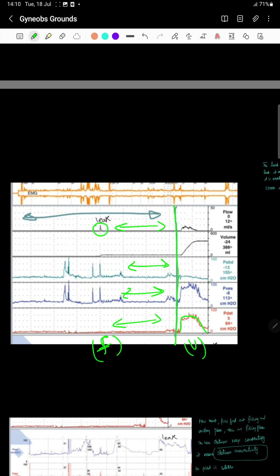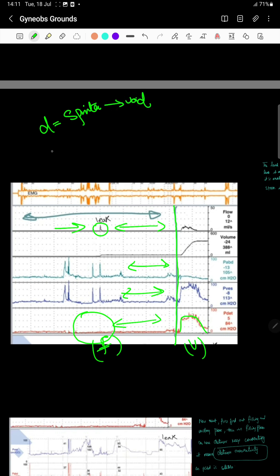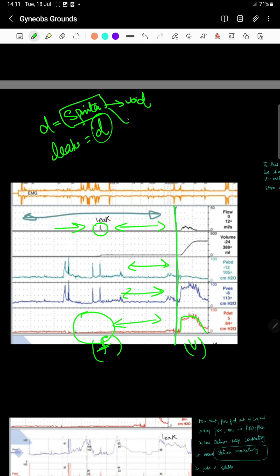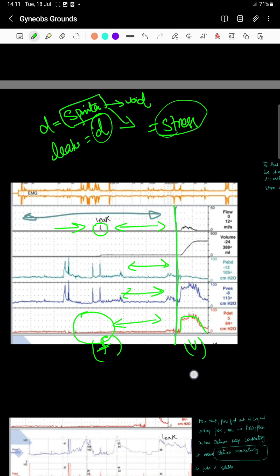Here you notice there is a leak during flow. But look at the detrusor pressure — the detrusor muscles show stability. So why is there a leak? When the detrusor muscles contract, they lead to opening of the sphincter and voiding. But here there is a leak despite stability of the detrusor muscle. This is because of weakness of the sphincter muscle — it is not able to hold the urine inside. This is stress incontinence: the sphincter is unable to bear the stress.